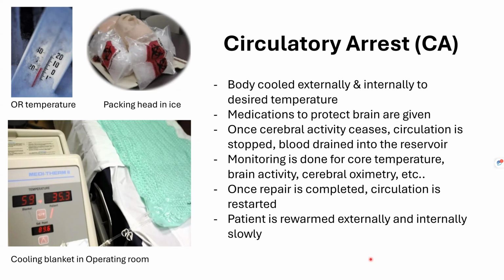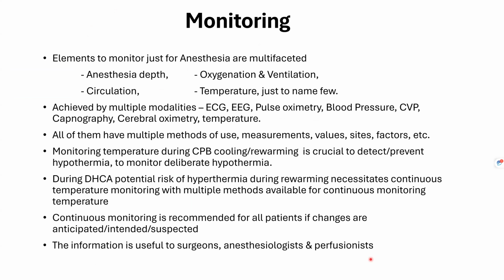Cooling can be done very quickly. It really is quick. But when you start rewarming, you really want to go very slow, because if you rewarm very quickly, the chances of organ injury at the cellular level are very high, because it can cause activation of a lot of different pathways and can create inflammation and cell injury. Also, it has increased chances of gaseous embolization. So rewarming takes longer than cooling. So this is what is done in deep hypothermic circulatory arrest.